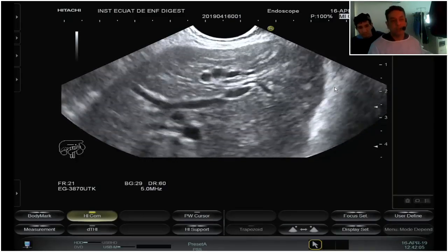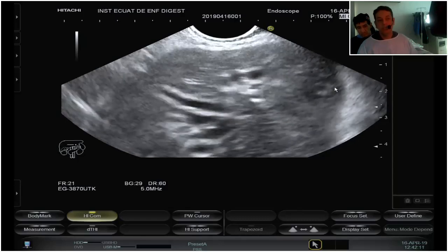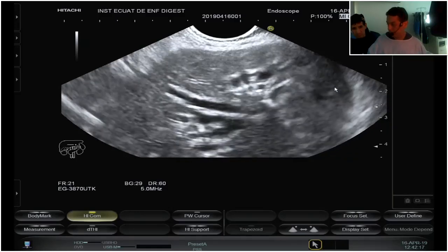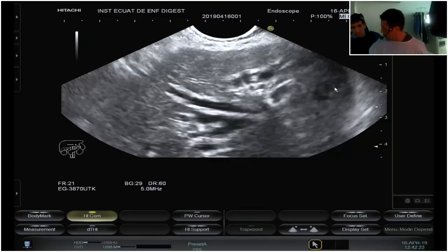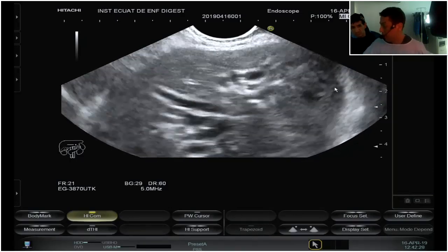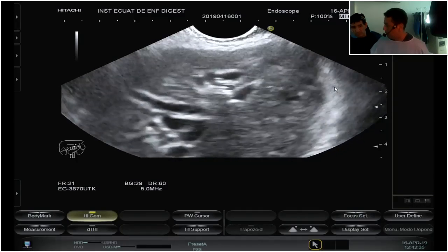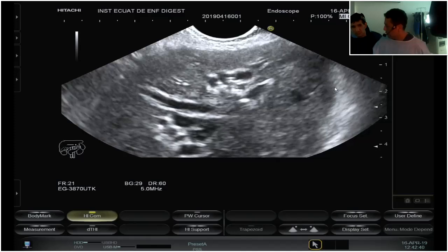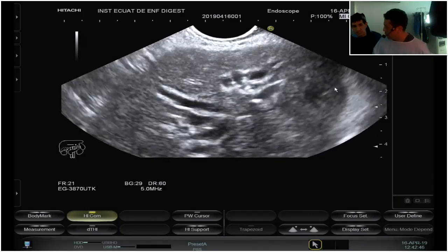So what is the advantage now? First, I can reach the biliary tract, and second, I can do cholangiography. I can perform aspiration and send this to the lab to be evaluated if there is any bacteria inside. And third, at the same time, I can do a liver biopsy just to be sure that this patient is not starting a liver cirrhosis. So I think there is a lot more advantage to doing this approach.